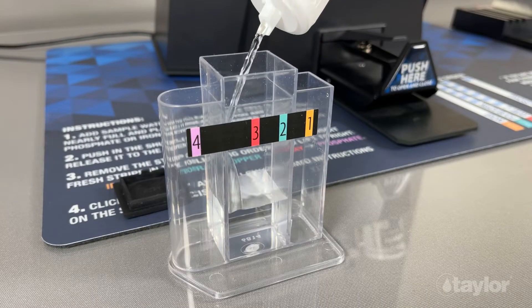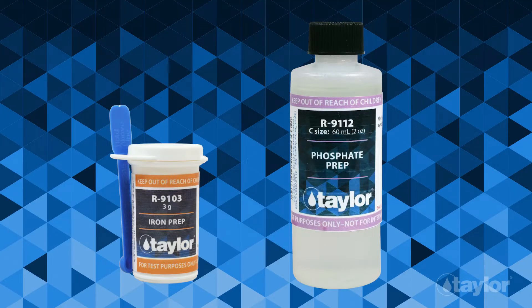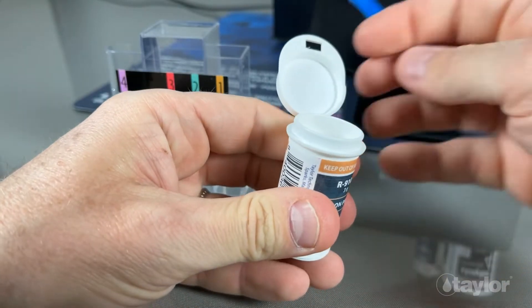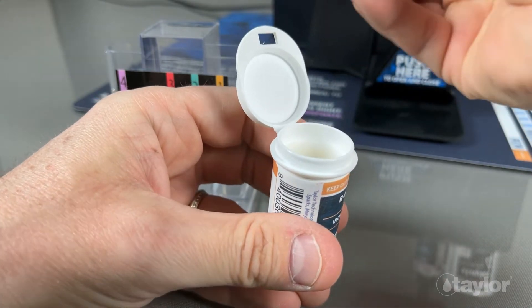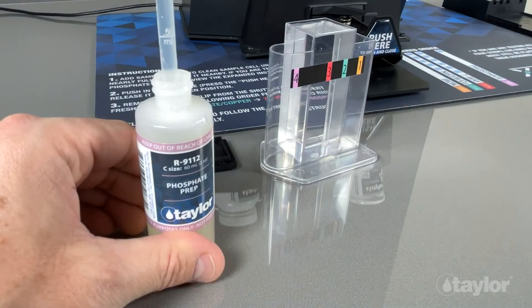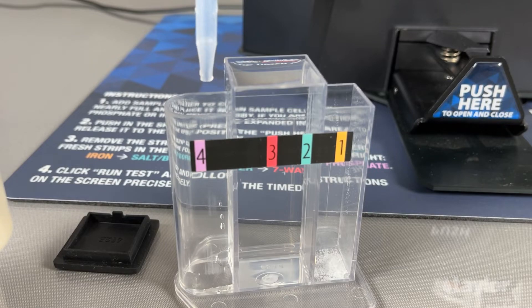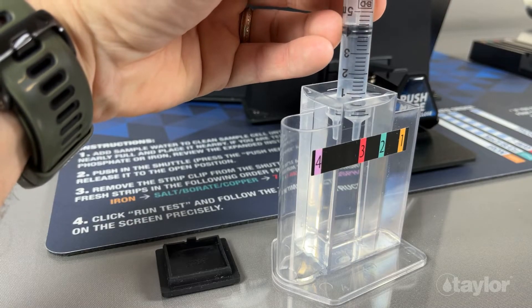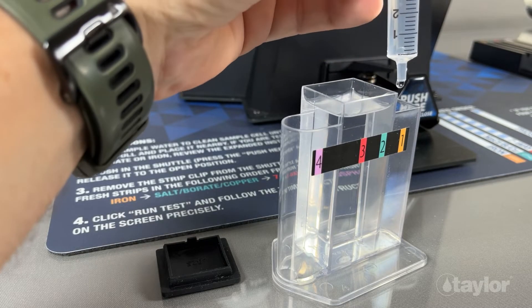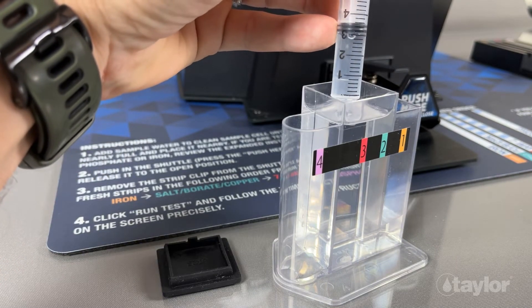Pour your sample water into the center chamber on the test vial. Add iron and phosphate test prep reagents to their designated chambers. Use the syringe to measure out 5 ml of sample water from the center chamber and add to the iron chamber. Repeat for the phosphate chamber.